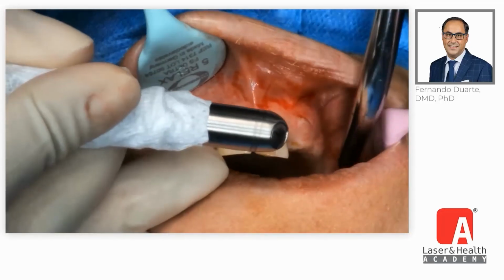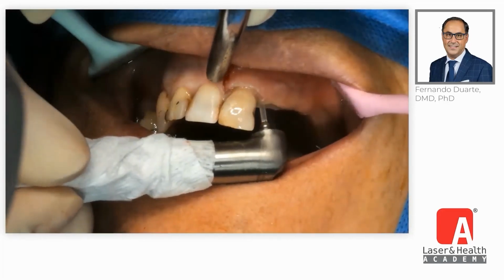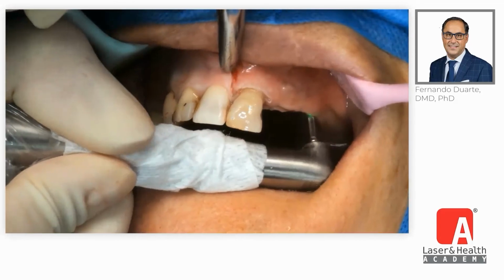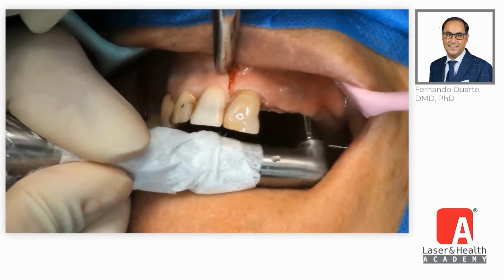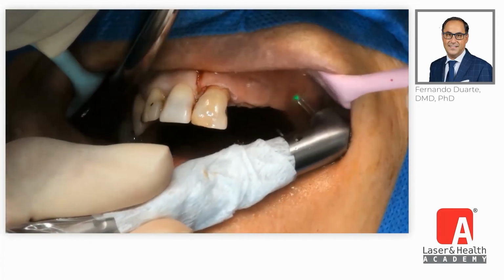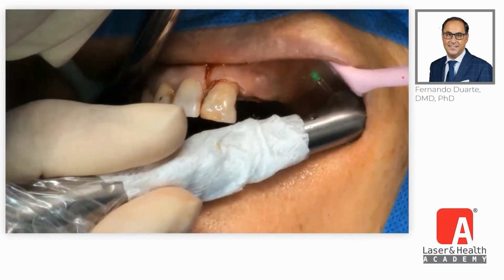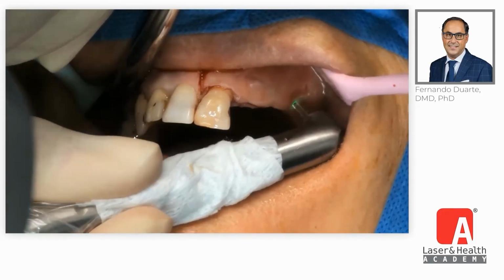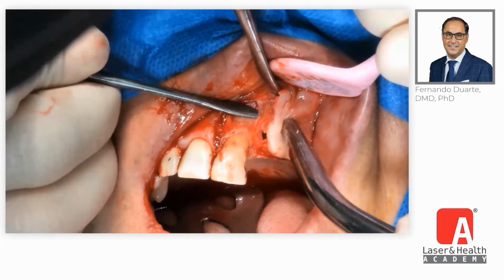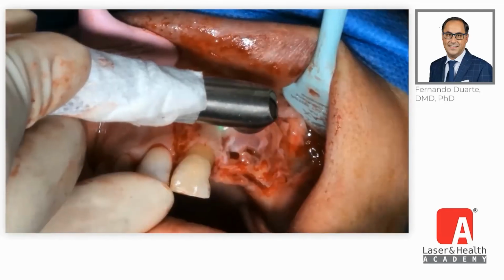And now let's see the video of the clinical case. We start with the incision with the erbium YAG and handpiece H14, very easy to handle, very precise. We use 150 millijoules energy, 20 Hertz of frequency, 3 watts of power, and also a combination for water-air of 4-2 in the LP mode. Detachment of the mucosa after raising the flap, and start to work in the hard tissue.